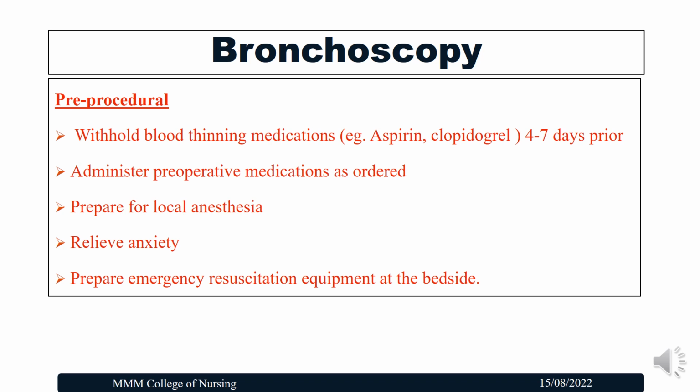If it is a flexible type of bronchoscope, we can do the procedure at the bedside, but if it is a rigid metal bronchoscope, we have to do it at the operation site. So based on the area where we are performing, the resuscitation equipment should be kept ready.